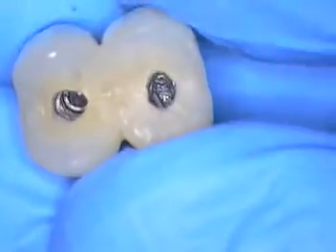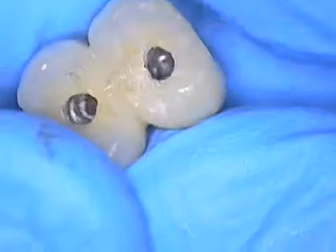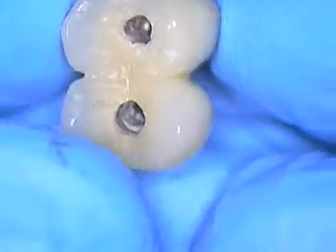I can see that. Lots of bio burden internally. I'm going to work in my buffer zone and see if we can gain access now. The screw access hole on number 14 is going to be through the lingual, so we'll have to open that up very carefully.